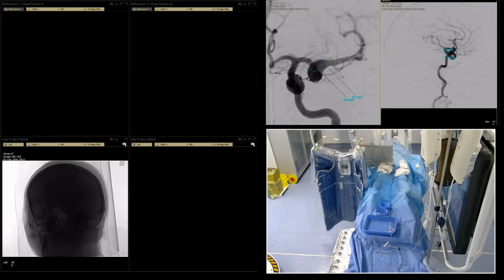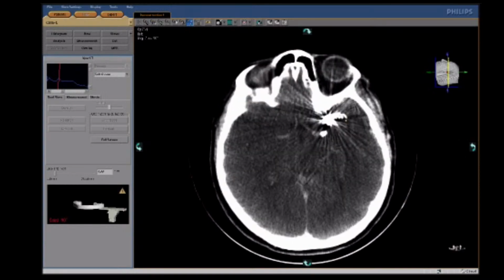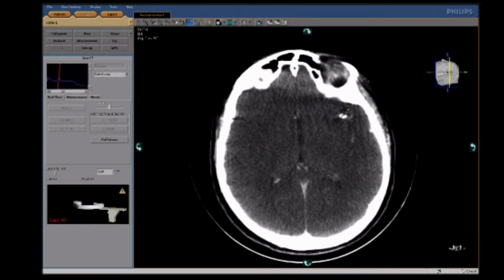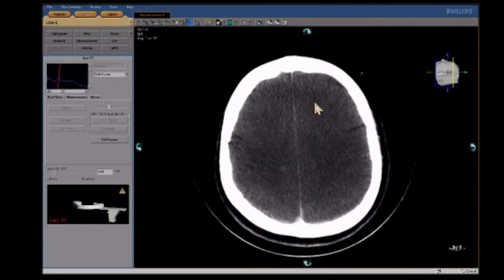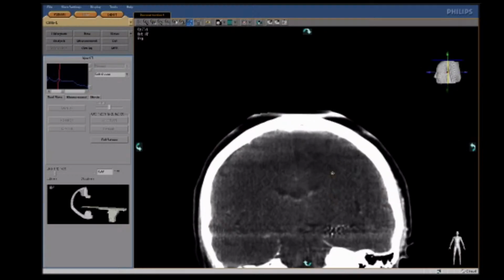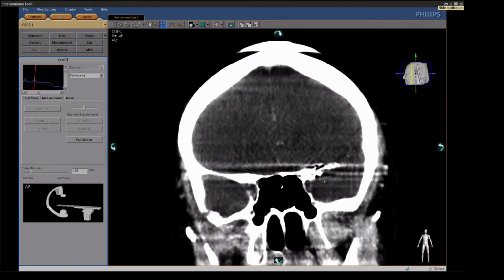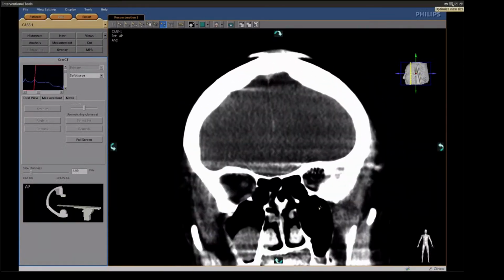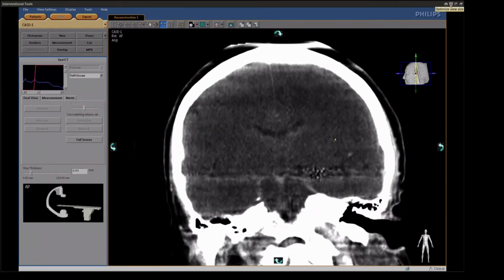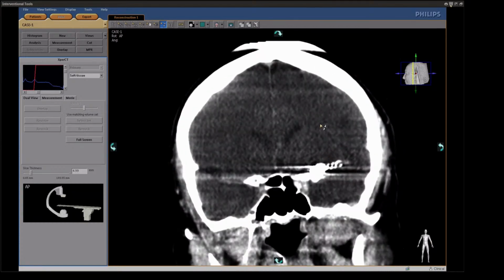CT is ready. Let's check the CT. This is proximal part of EVO. It's inside the MCA. Then it goes to the distal part, and brain is clear. Yes, it would be the step treatment, and the next treatment we will plan in April. It's February, March, April. Okay. Patient is okay. She's feeling good. Okay, see you in next 20 minutes. Next case is ICA stenosis. Okay, thank you.